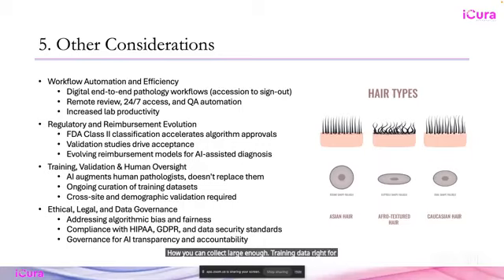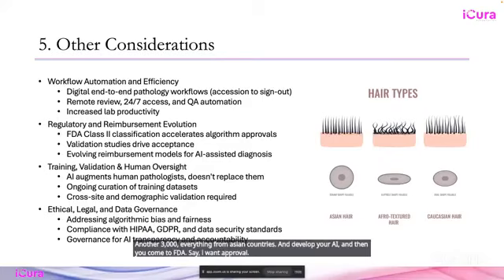For example, you're trying to develop something for ductal carcinoma, breast ductal carcinoma, and you probably want to include all the potential racial ethnic group samples where you can have that algorithm correctly deal with the potential future use cases, right? You can't just collect, like, 10,000, another 3,000, everything from Asian countries and develop your AI. And then you come to FDA, say, I want approval. And then FDA approved it.